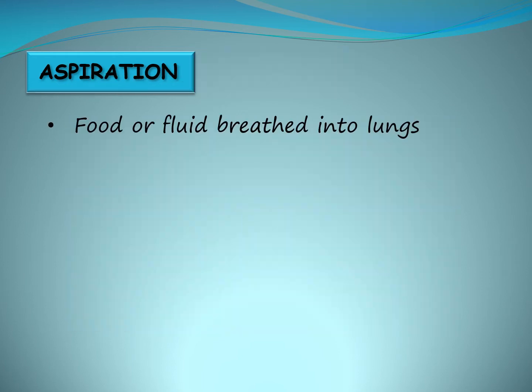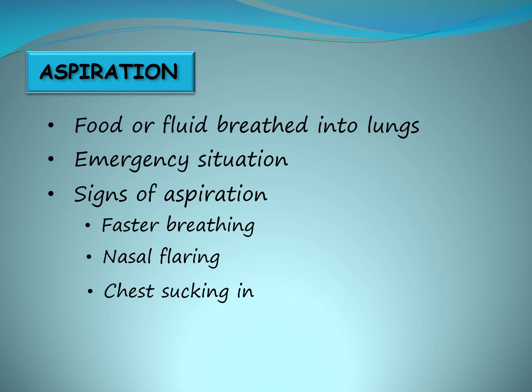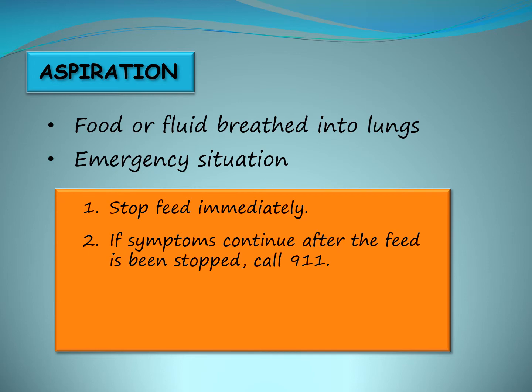Aspiration occurs when food or fluid back up into the esophagus or mouth and is breathed into the lungs. It is an emergency situation. Signs of aspiration include faster breathing, nasal flaring, chest sucking in, wheezing or noisy breathing, grayish or bluish lips, mouth, or nails. If the child shows any of these signs, stop the feed immediately. If symptoms continue after the feeding has stopped, call 911. Notify the parent. Stay with the child until paramedics arrive.